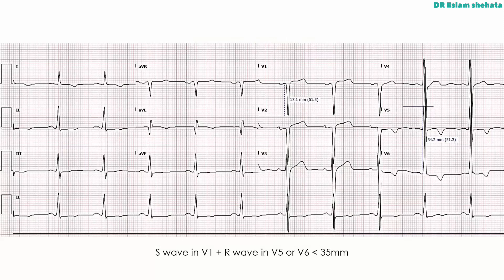I've thrown in this example here — the S-wave depth is 17.1mm in this lead, and when the ECG is on the computer it's great because you can measure these things quite precisely. Over in V6 we've measured it and it's 34.2mm. So this obviously adds to more than 35mm, and so this is left ventricular hypertrophy.